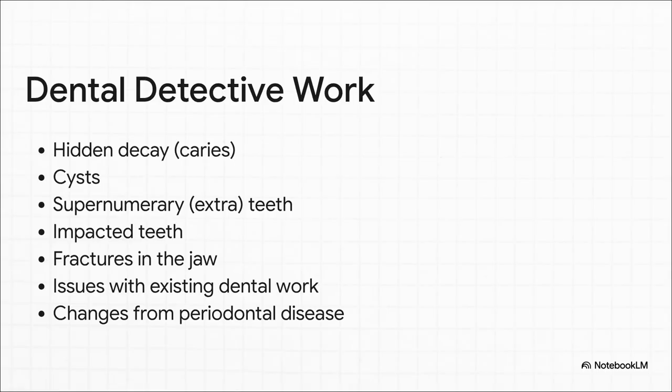X-rays are the tool dentists use to hunt for clues you just can't see. Things like hidden decay or caries, cysts, even extra teeth hiding in your jaw. They're on the lookout for impacted teeth, little fractures in the jaw, problems with fillings or crowns you already have. It's just an absolutely essential tool for getting the full picture of what's going on in there.